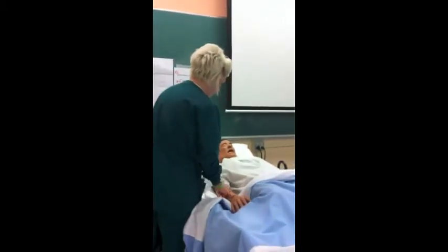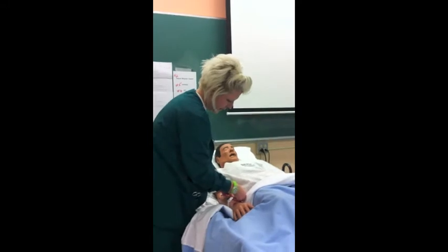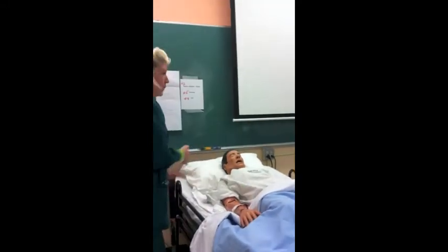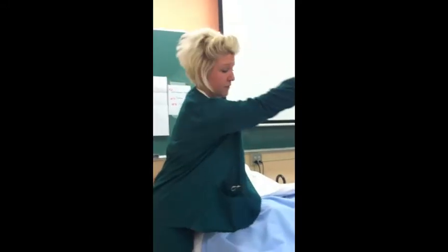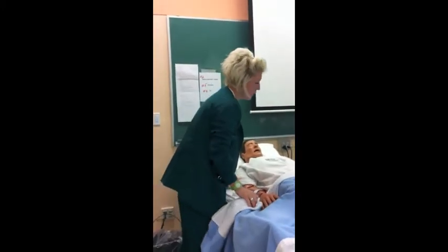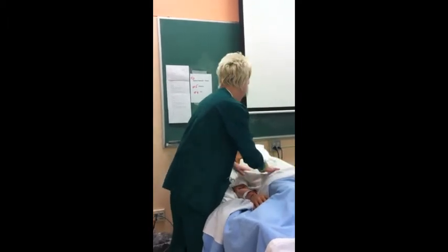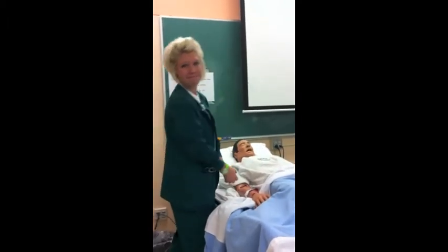Hello, how are you? My name is Kristen. I'm doing respiratory. I'm going to be changing your colostomy bag today. Allison, how are you? I'm going to pull the curtain to ensure privacy for my patient. My patient is in a comfortable and safe position in bed, and I'm going to explain to her that I'm going to be changing her colostomy.